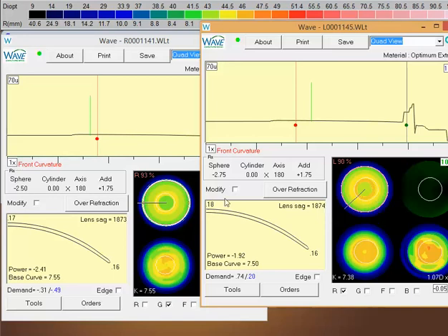So I think if you get the fit down a little bit better, you'll get a little better translation on the lens with a flatter lens, and that may allow this lens to move a little bit more when they go to read. I would incorporate the over refraction and go as much plus as you can possibly get away with, and see how you do. If not, if you really want to push the envelope on getting near vision out of this lens, you could try taking that left eye, which is the non-dominant eye, and switch it to a near center. Think of an Air Optix multifocal type lens. And so hopefully that answers your questions.